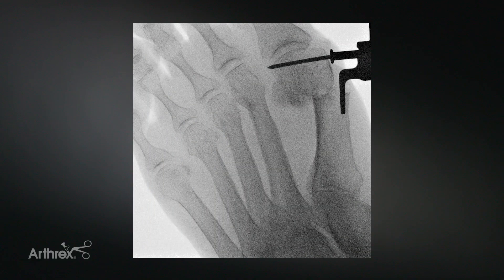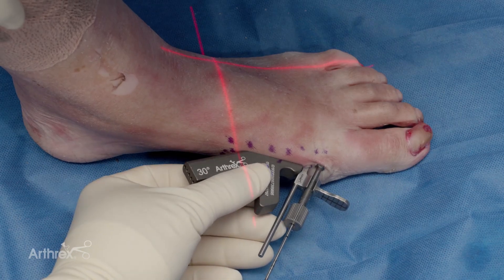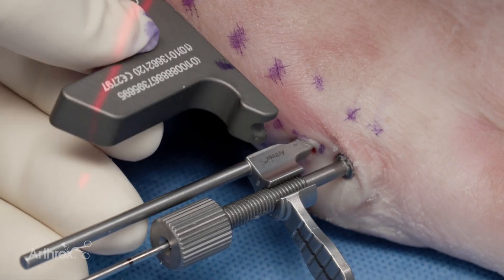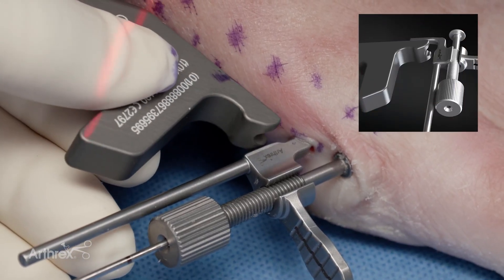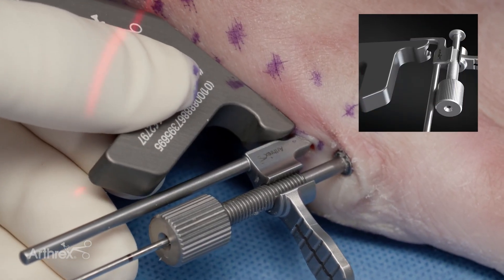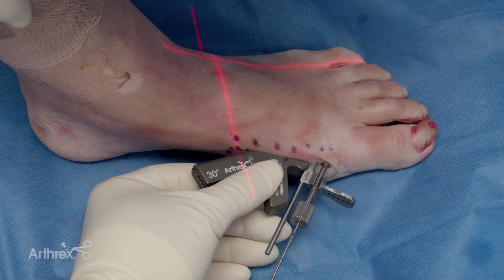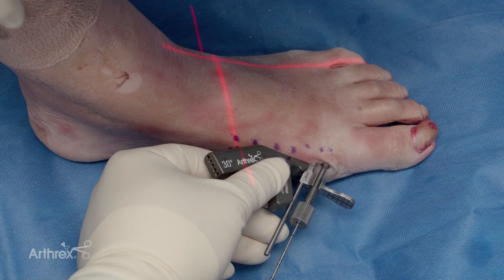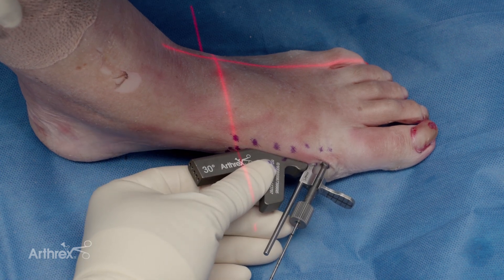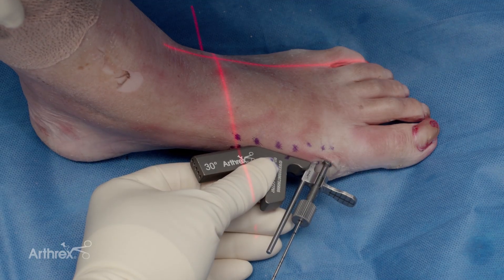You can see we've shifted probably 50 to 60 percent. Here you can see the 30-degree parallel guide and the notch at the very tip, which fits in nicely with the shifting device — giving a nice lock right in through that area. You still need to be cognizant of shooting these pins too dorsal or too plantar, but the marks on the skin and the notch in the guide help lock it into position.